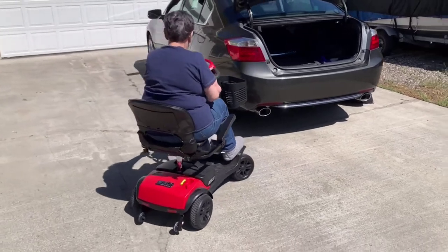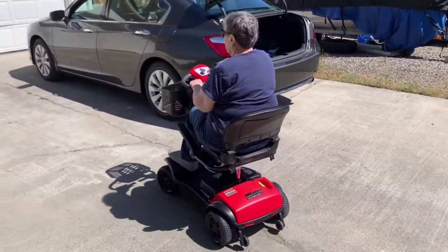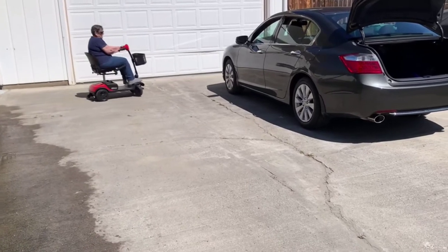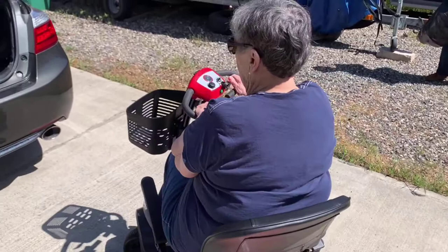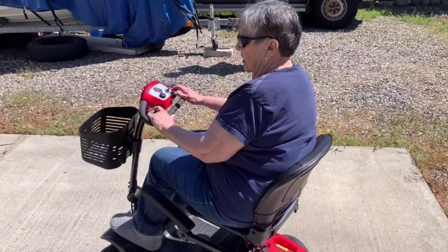There you go — demonstrating the scooter driving around.